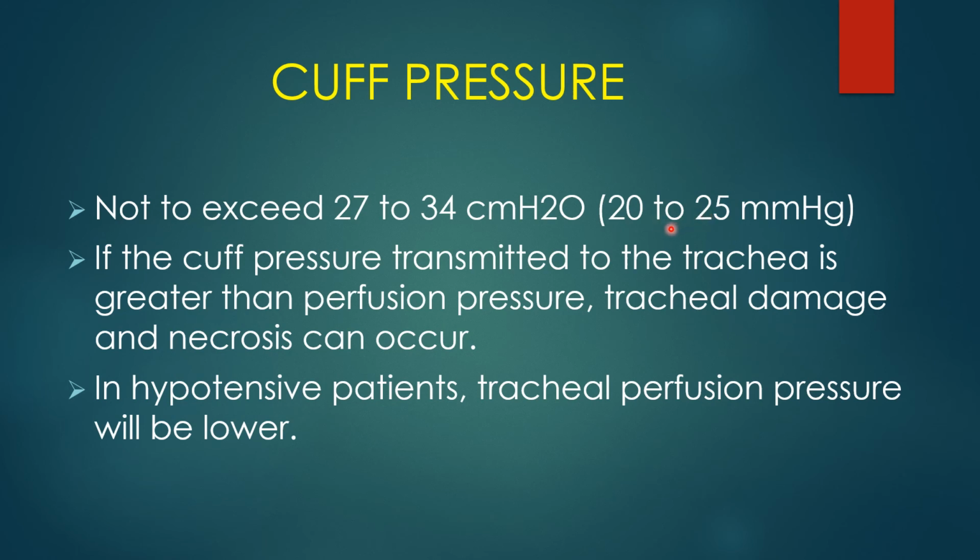So if the cuff pressure exerts pressure on the wall that exceeds 20 to 25 millimeters of mercury, you stop blood flow. You stop oxygen delivery, and then you have damage or even necrosis of that tissue.